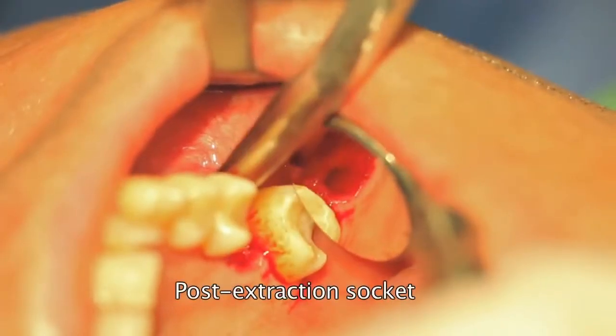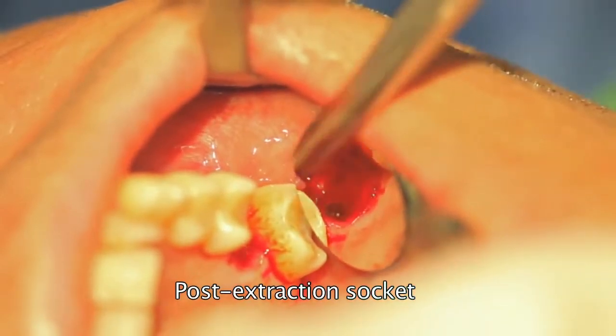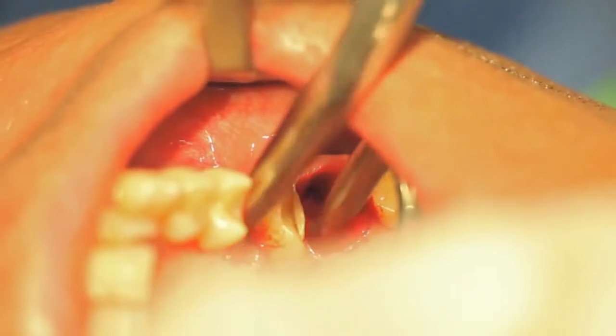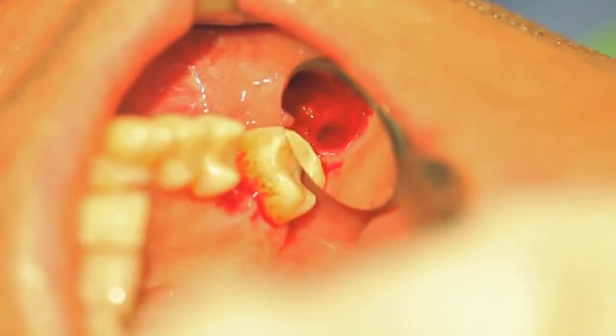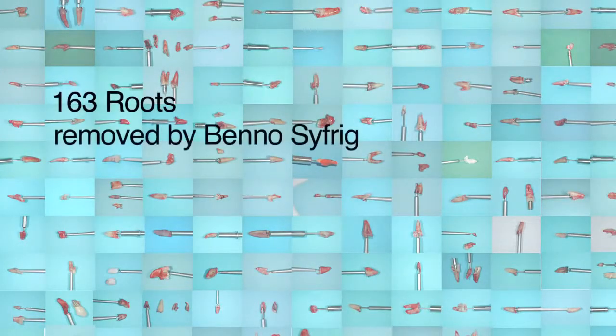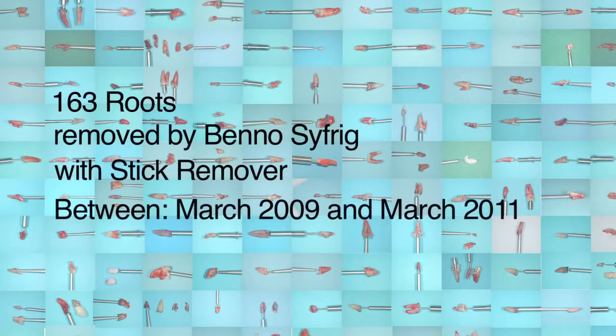The post-extraction situation shows the ideal preservation of soft and hard tissue. More information can be found at benextent.com.